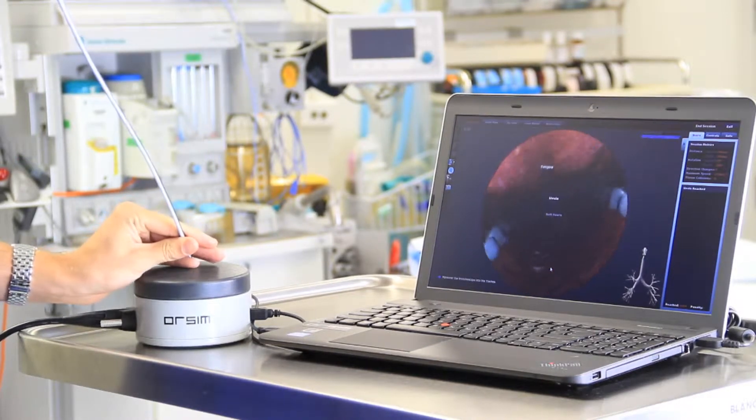It's realistic, it's fun to use, it's very portable, it has a range of difficult airways, and it prepares you for real-life scenarios.